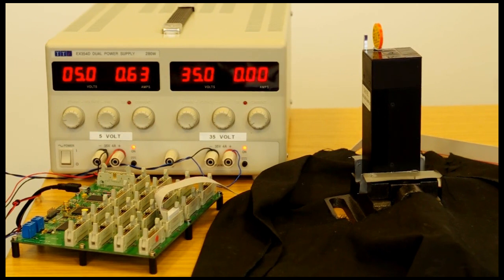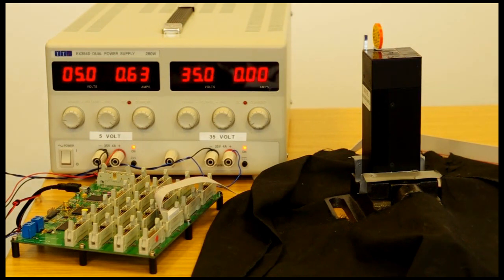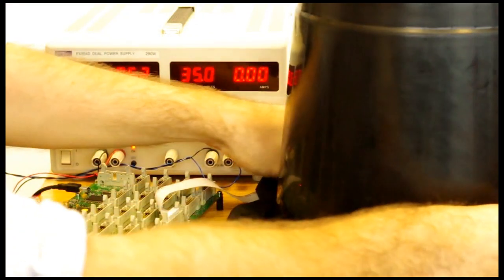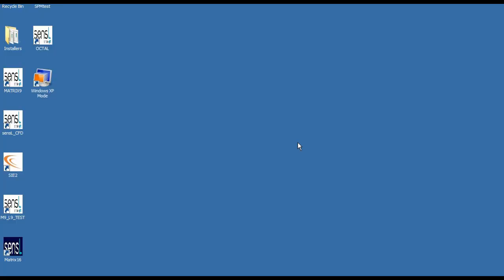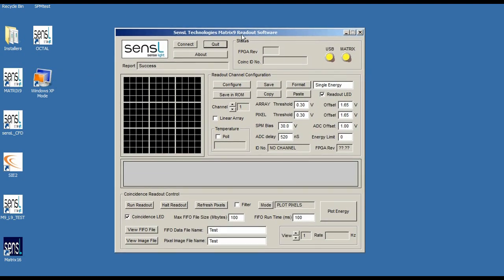We have a single pixel with a crystal on it already shown in this configuration. Now we're going to put it into the light-tight container and load up the Matrix 9 software on the screen.